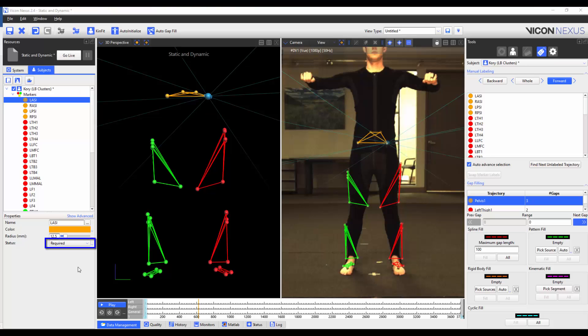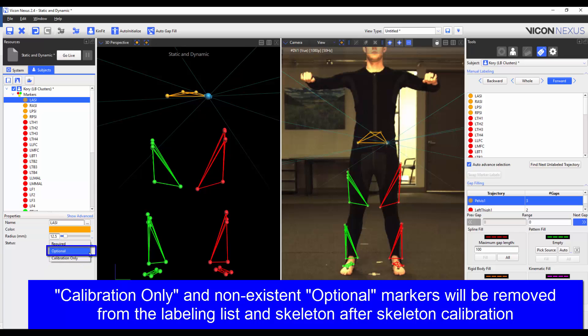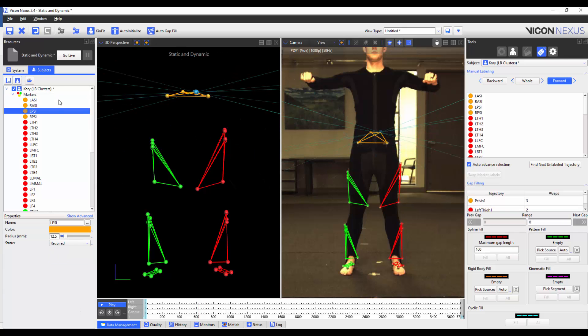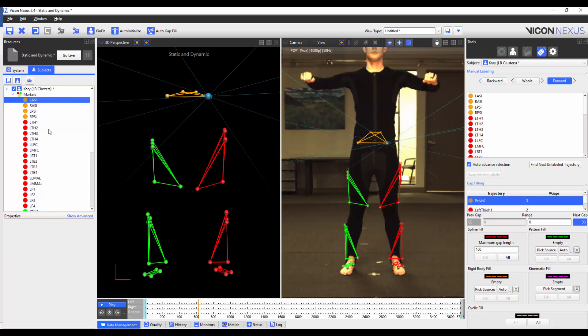We can set the marker status to Required, where the marker has to be in both the calibration and dynamic trials, or to Calibration Only, where the marker is only required to be in the calibration trial, or as an optional marker, where if it's present in the calibration trial, it is treated as a required marker. If it's not present in the calibration trial, the marker is treated as a calibration-only marker. By default, the first three markers on a segment are set to Required. Every subsequent marker is set to Optional. For my VST, I'm going to set all of the markers on the cluster to Required, and those that are on the knee and ankle joints set to Calibration Only.